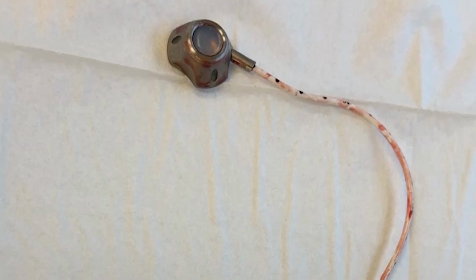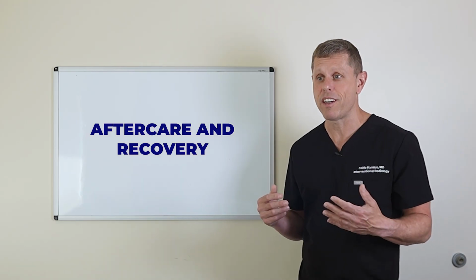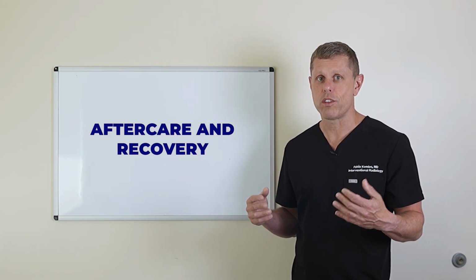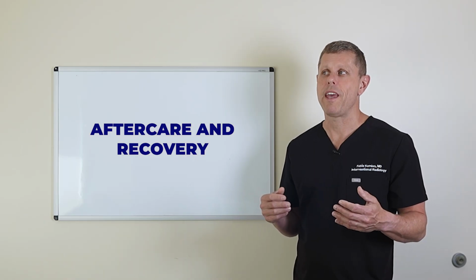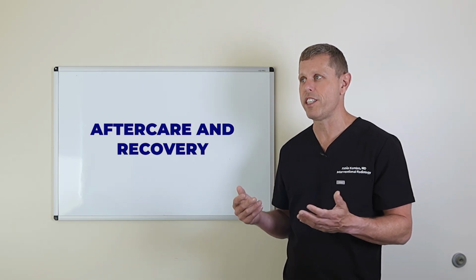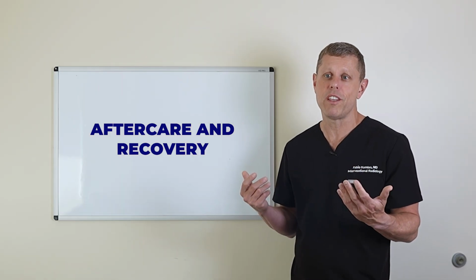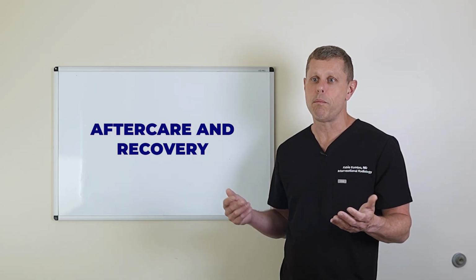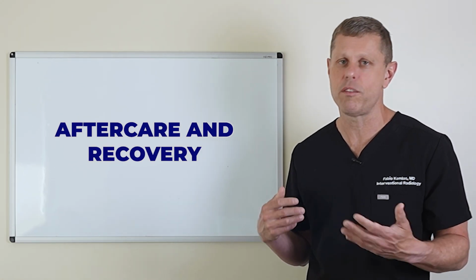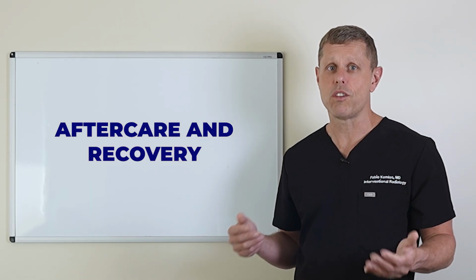Again, for ports, this is very low maintenance unless the port's being accessed. And before removing the needle, usually the nurses will flush it really well so it's clean inside. They may tell you that in general, if you have a port, it's probably a good idea to flush it every couple of months to make sure it's working. But my opinion is that if you are not using a port for a couple of months, you probably should have it removed, because they can always be installed again if needed. If you're not using it, there's no reason to keep it.